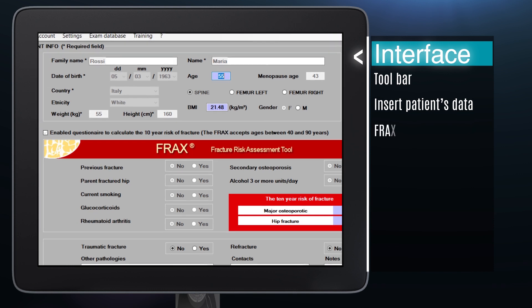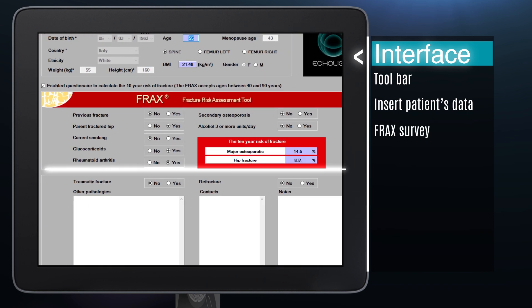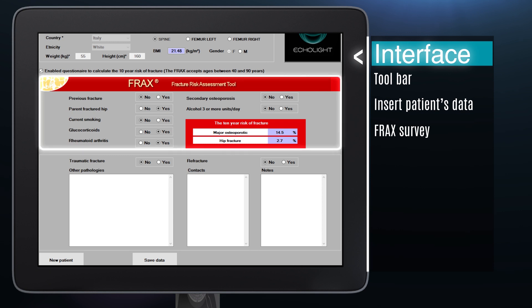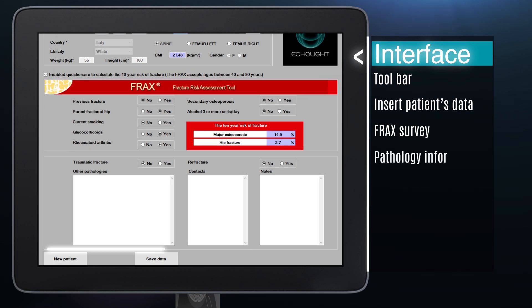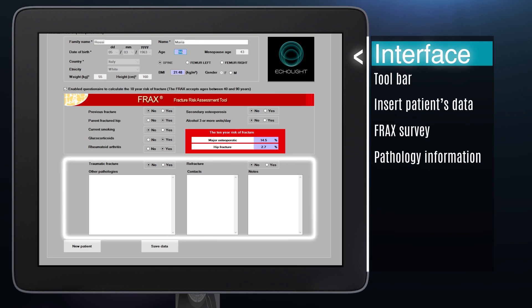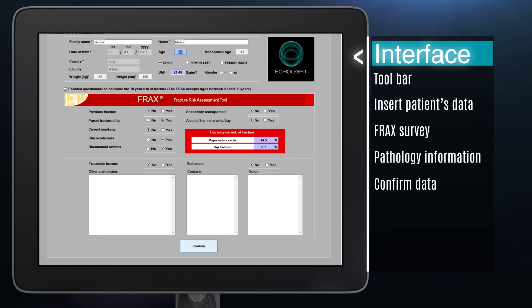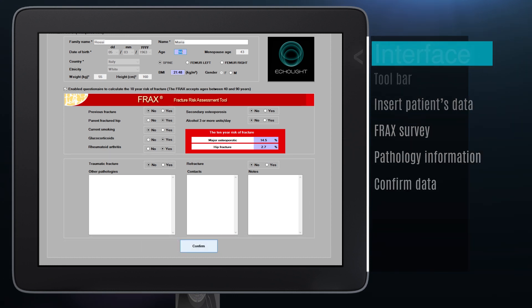The FRAX form for patients aged between 40 and 90 years is in the middle section. The bottom section can be used to insert the patient's history, pathologies, contacts and other information. Confirm data by clicking on save data and confirm.